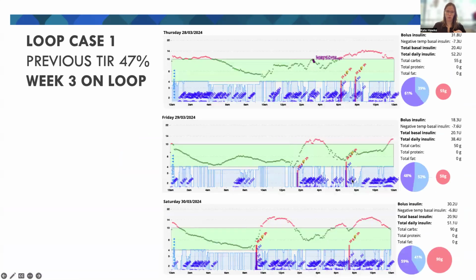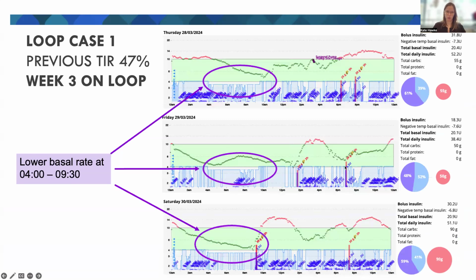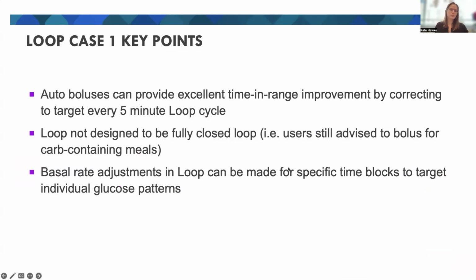And that was pretty successful in averting those 8 a.m. lows. So you can see now, just for the sake of practicing how the Nightscout appears, you can see that we have a scheduled basal reduction here at 4 a.m. And that's with this light blue shading dropping down there. And yeah, slightly lesser insulin delivery through that time, and not having those frank lows.